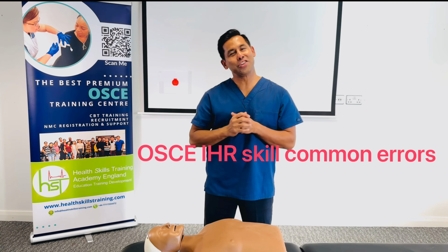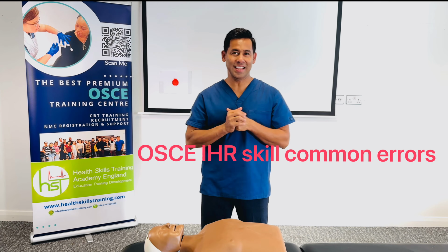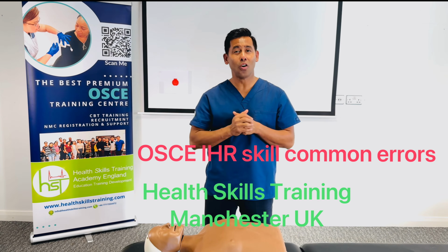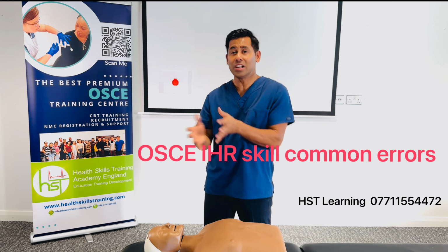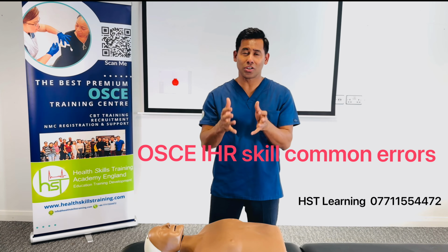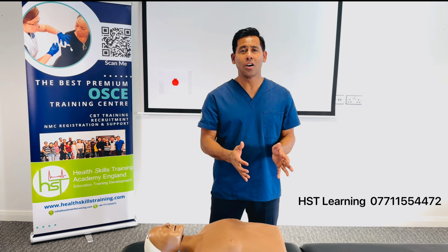In-hospital resuscitation. This can be a tricky station in your OSCE. There might be a lot of errors which you want to know, how do I fix them? It might be head tilt chin lift I'm not doing properly. My hand position in the chest compression on the dummy might be too high or too low.